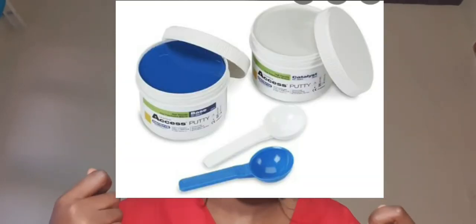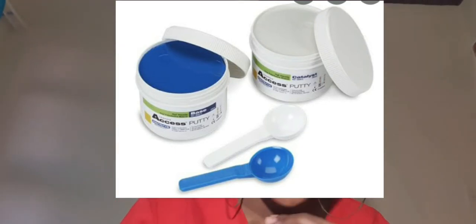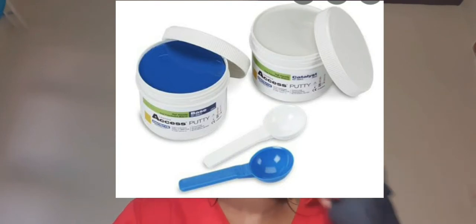Silicones normally come with their own little scoops, like teaspoons, for you to take one scoop of the base and one scoop of the catalyst. Please also do not mix the scoops, because then it will cause a reaction. If you use the same spoon to pick up both the base and the catalyst, you're going to cause cross-contamination, which will cause the material to be hard and useless. So basically it's a waste of money. So please do not do that.